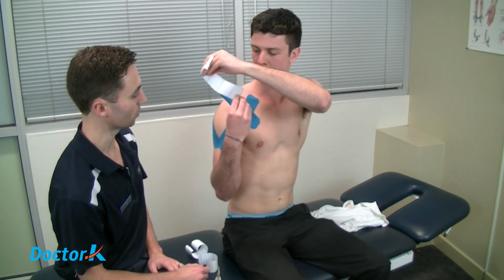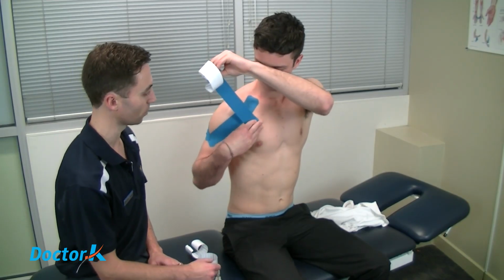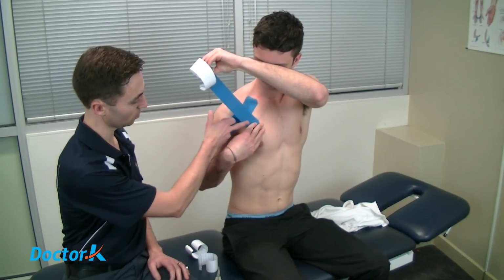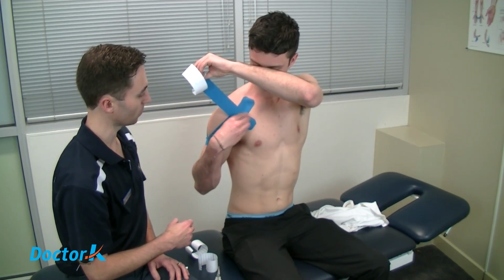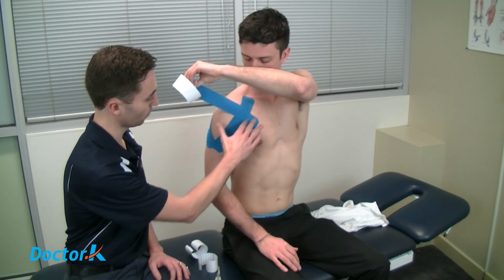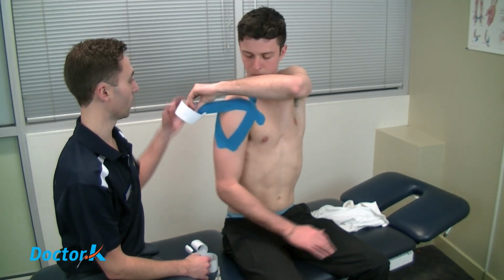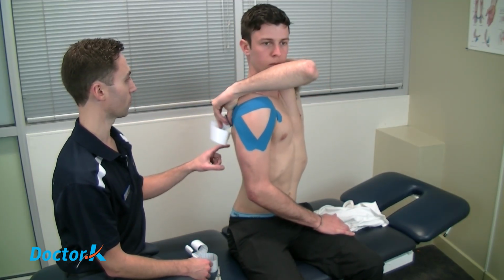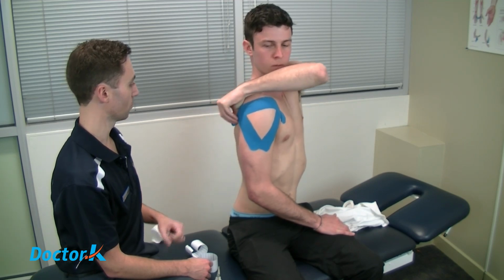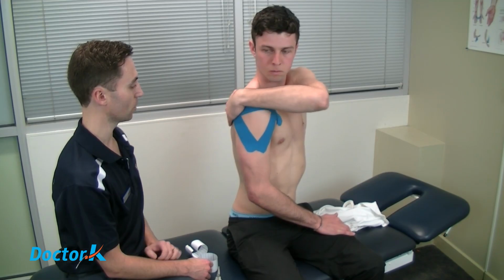And we're going to just gently apply the first piece without too much tension so it starts to cross that area of your shoulder without bunching the skin underneath. So just rub it a little bit onto the tape just so that it sticks properly in that area. That's the way. And once that piece is adhered effectively, we can follow the contour of the shoulder around, and then we're going to aim to cross the tape at the back there and finish on our shoulder blade. Last piece goes on without any tension. Give it a rub to make it stick.